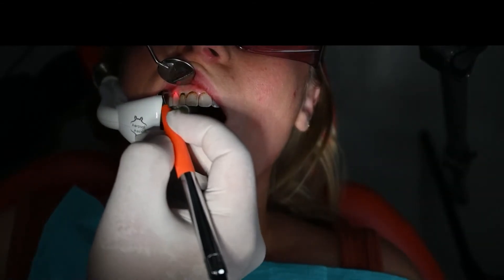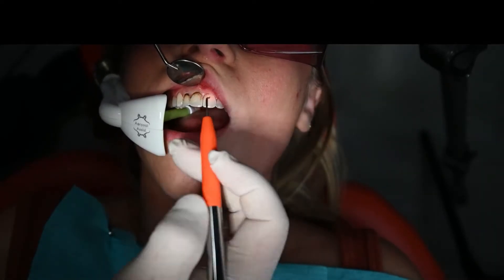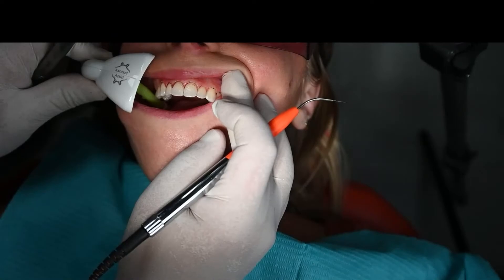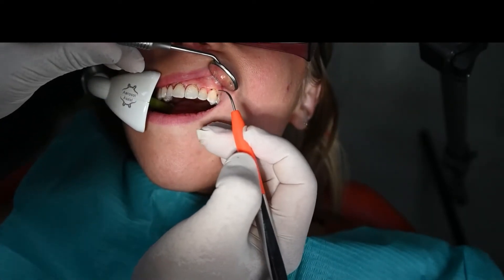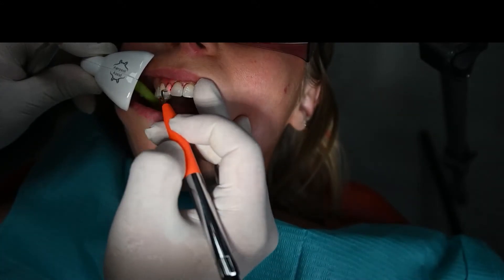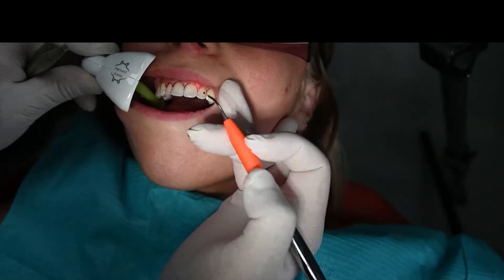Floss that has been cold sterilized can be used to measure a vertical line, but we opted to use the patient's lips. Although the practitioner is working alone, the aerosol assist automated and controlled the laser plume, intraoral fluid, and splatter. It was also used as a retraction device.